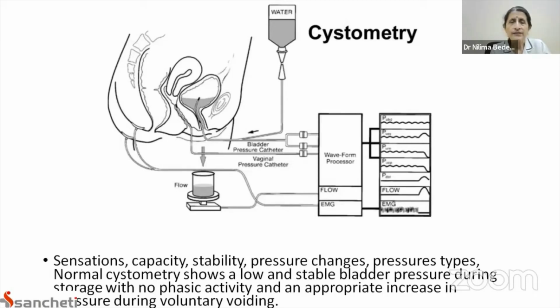And then for the bladder sensation of first filling, the person may notice something between 50 to 100 ml. But normally at 150, the person will feel, yes, I feel that there is fluid in the bladder. During this time, the rate of the fluid or the water into the bladder needs to be very specific, it cannot be very fast. Slow can be okay, but the time required will be so much more.